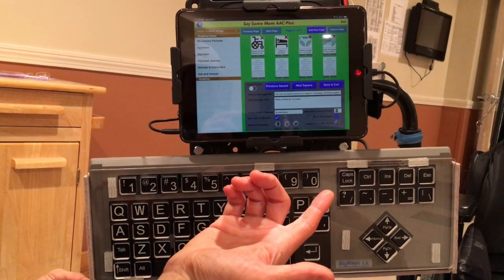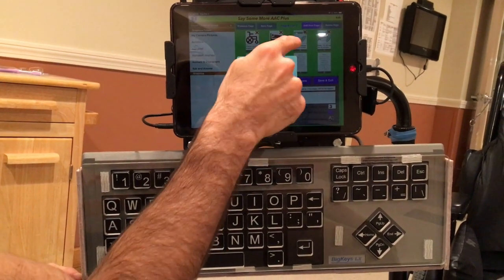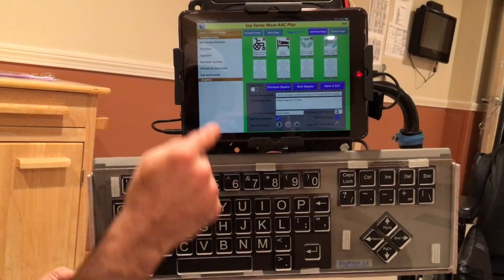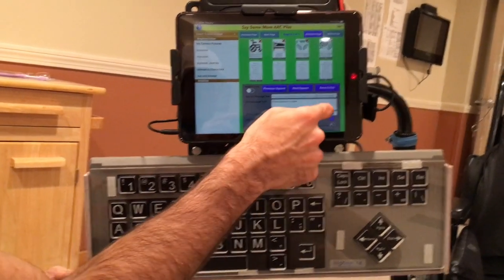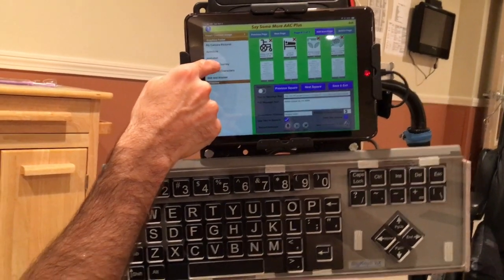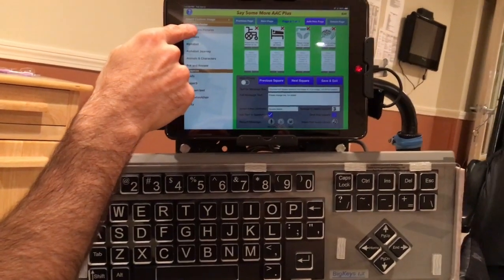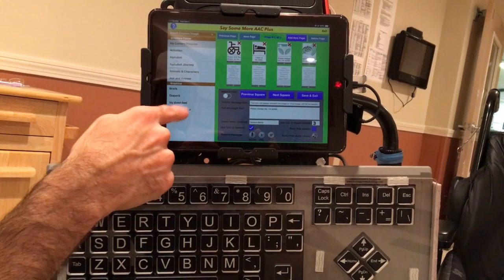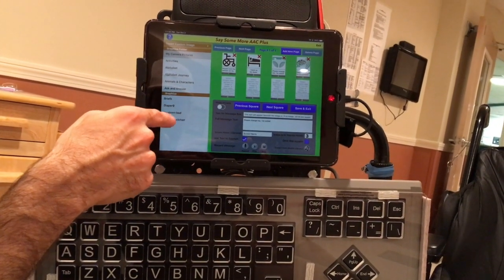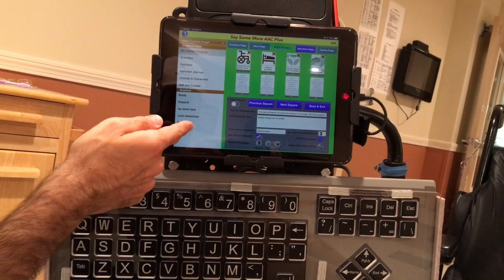If you want to change the icon, that involves clicking here. It says select graphics. So this is how the icon changing works. We're in box number 3. You have to find a graphic you want, and the easiest way is to go to My Camera Pictures. That's for the ones that you can save on the iPad. I went to a web browser and saved these icons by doing a screen capture and saved them in the camera roll of the Photos app.